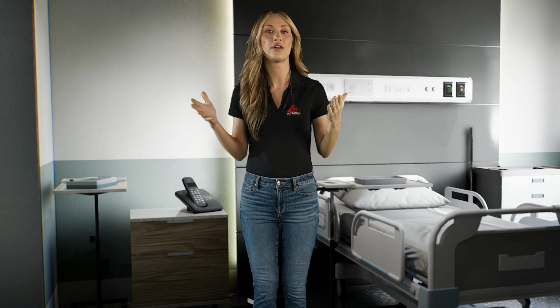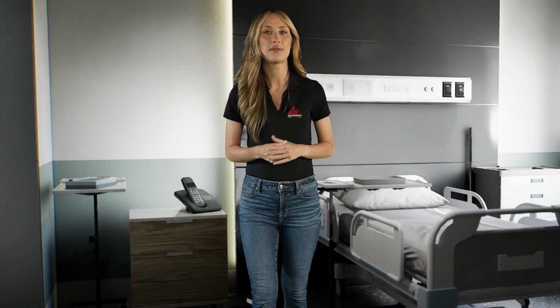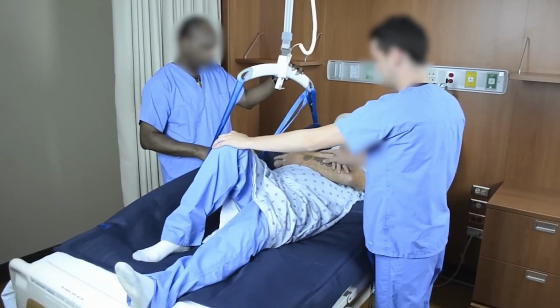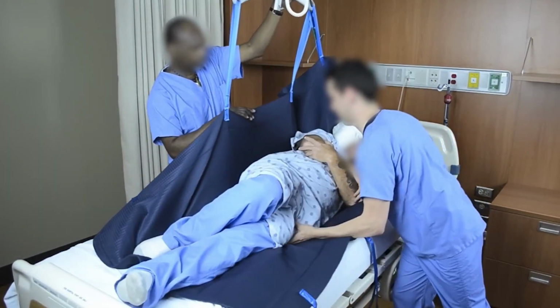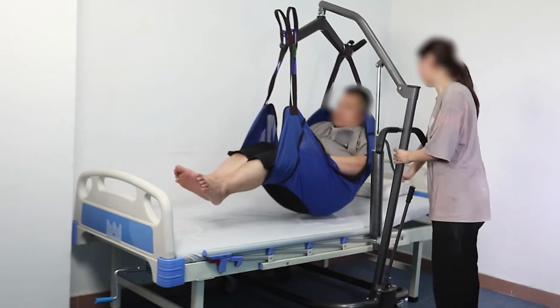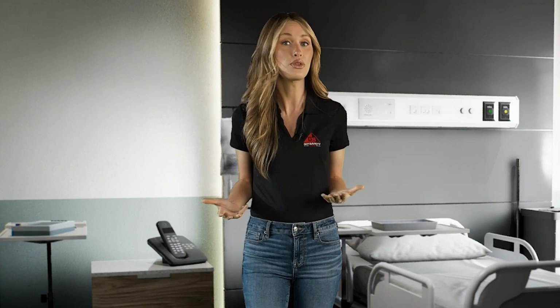To tackle the hazards we just talked about, there's a whole arsenal of equipment designed to make patient handling safer and easier. Many healthcare settings like hospitals, nursing homes, and even private home care services have stepped up their game by using specialized patient handling and mobility equipment. Let's run through some of the key tools you might come across. There are repositioning slings and limb support slings designed to help adjust a patient's position safely. Then there are full body sling lifts. These come in various models like floor, overhead, and ceiling lifts. They are a game changer in lifting patients smoothly and safely.